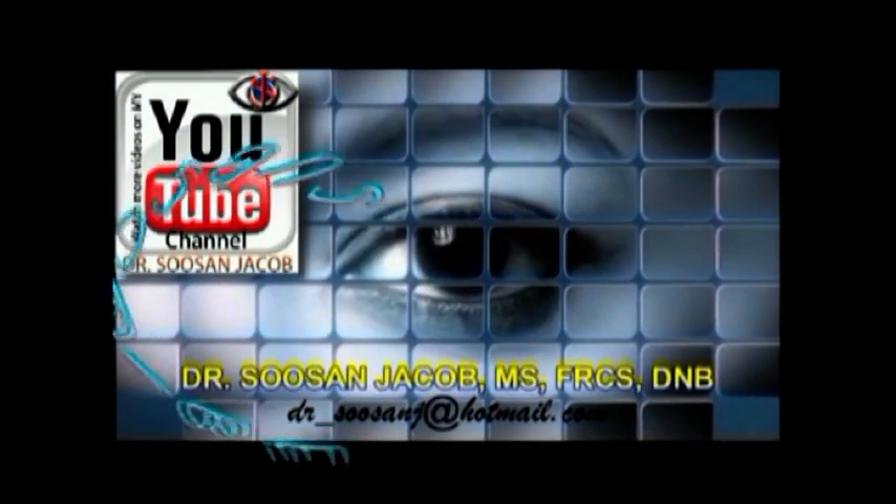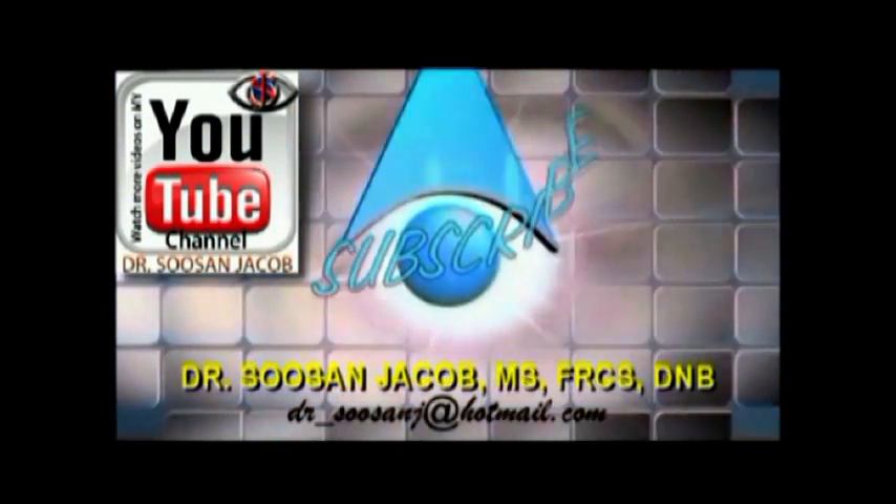Hi everyone, I'm Susan Jacob and in this video I'm going to show you posterior polar phacoemulsification.